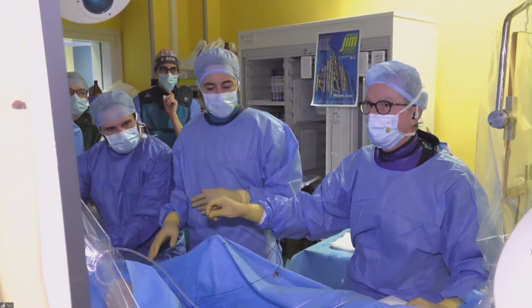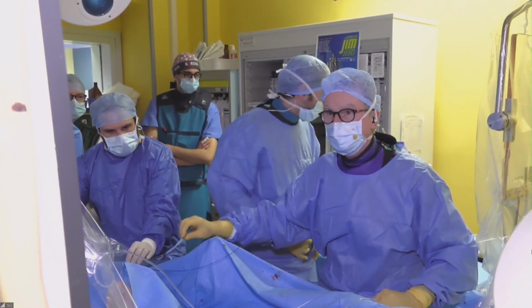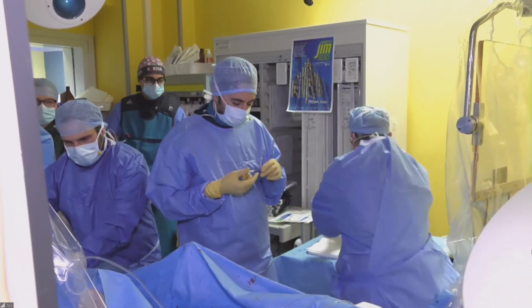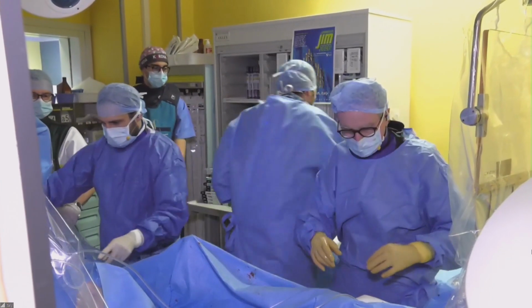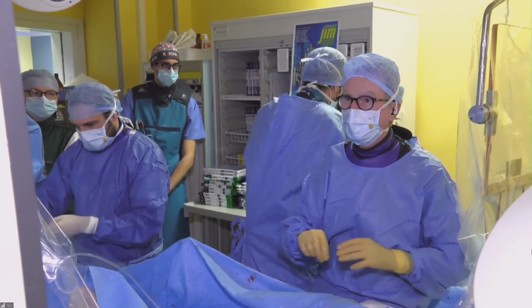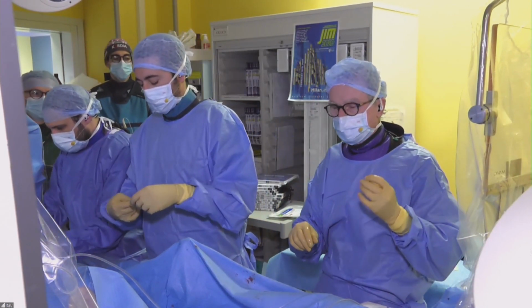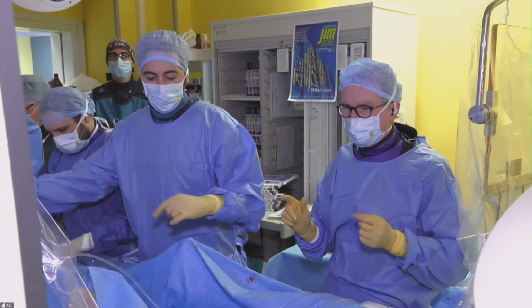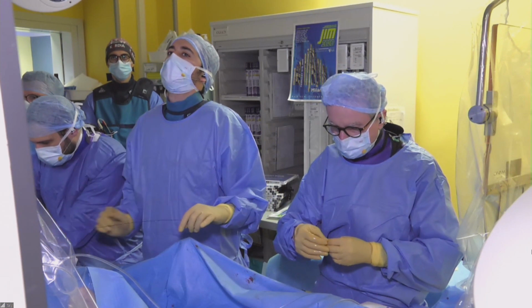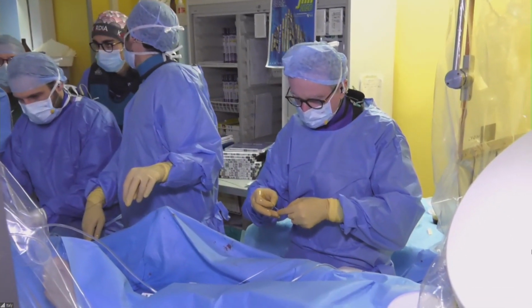We have a 3.0 by 12 non-compliant balloon. If you want to go to Dr. Giannini, I'm going to predilate because there is calcium with a 3.0 non-compliant, and then place a 3.0 by 12 millimeter stent there. And you will place it just before the aneurysm component? Before the aneurysm, right at the end, right at the bifurcation. But I'm not going to go into the brain. Okay. 1000 of heparin. Perfect.